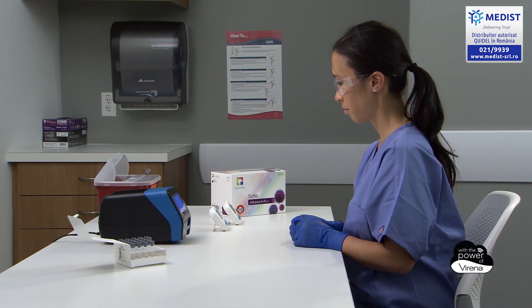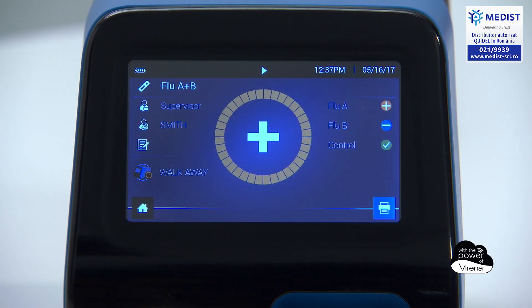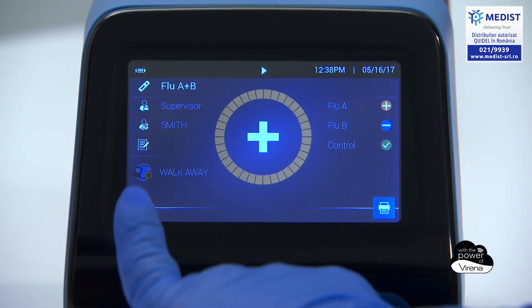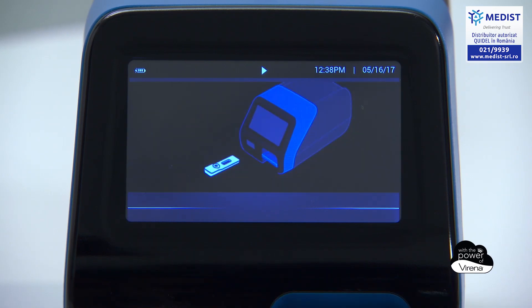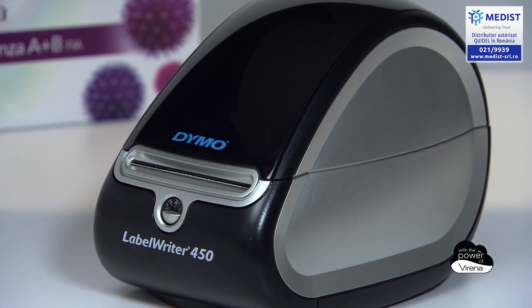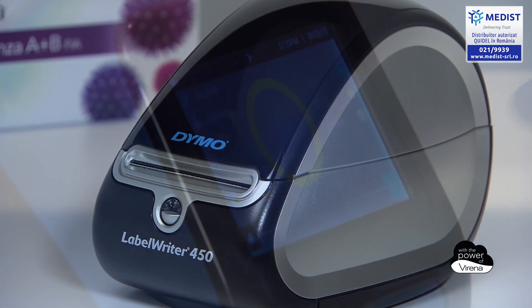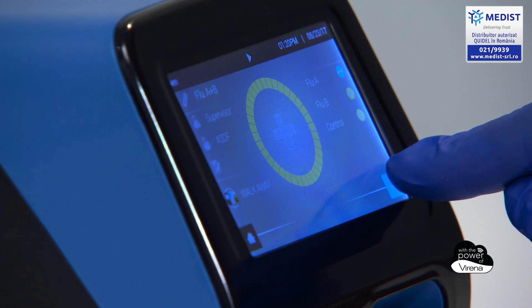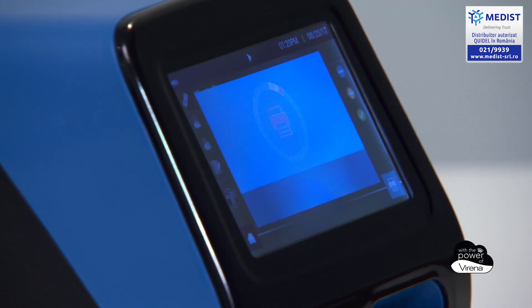After 15 minutes, Sophia2 will report a negative result or a positive result which was not previously called at an earlier time point. If users connect the optional external label printer, the result can be printed at this time.